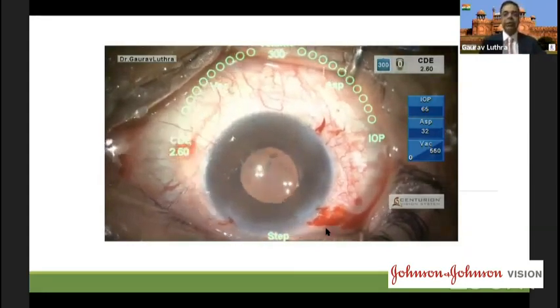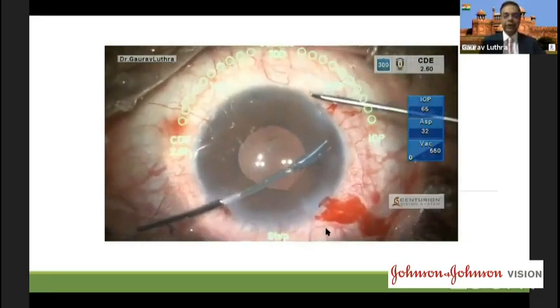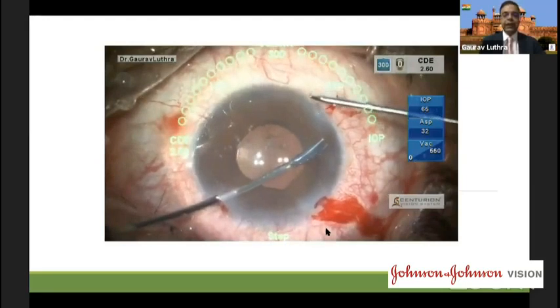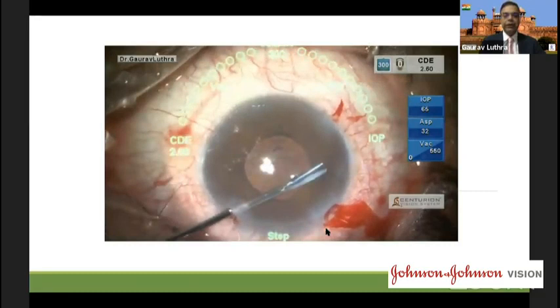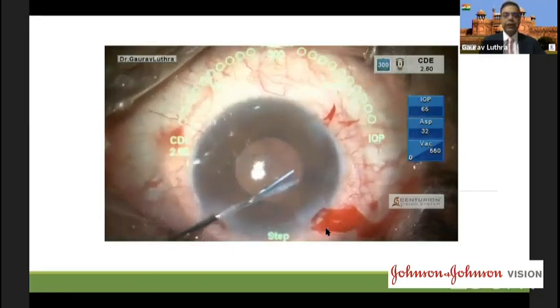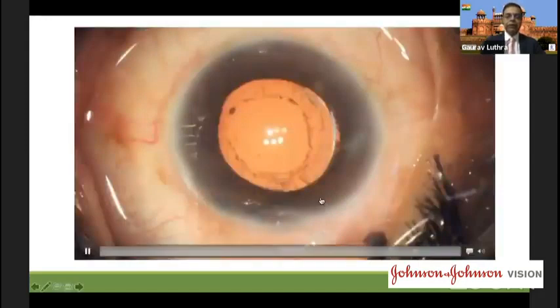If you make more than four, you are just getting a thicker knot. Four is just fine and it almost never gives way, and then you can just go in closer there. So it's like a slip knot. You just have to pull on the free ends on both the sides, and as you pull on the free ends, the knot tightens up, goes inside, and it tightens perfectly in place, and you can see you get the perfect pupil.